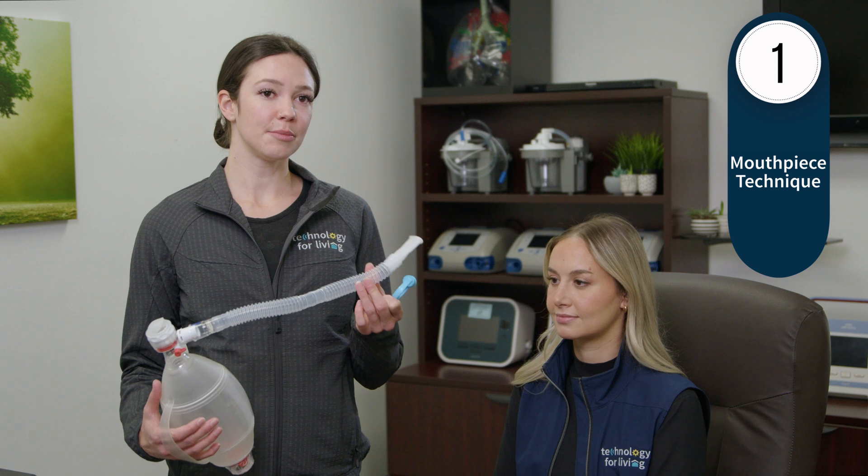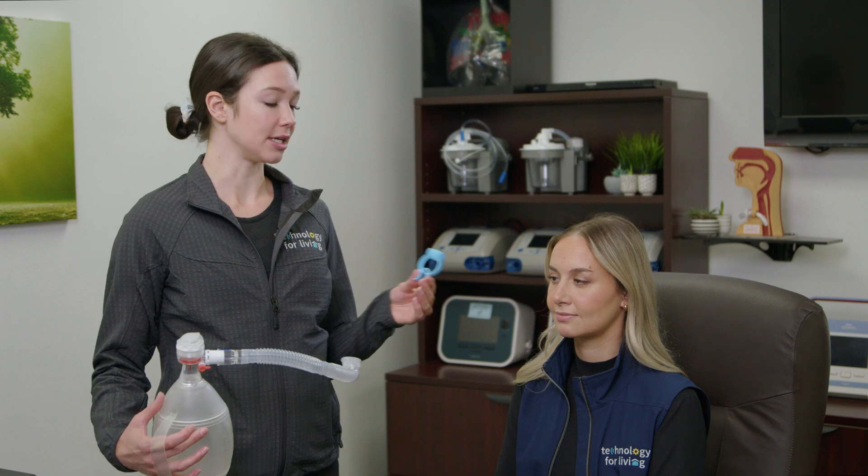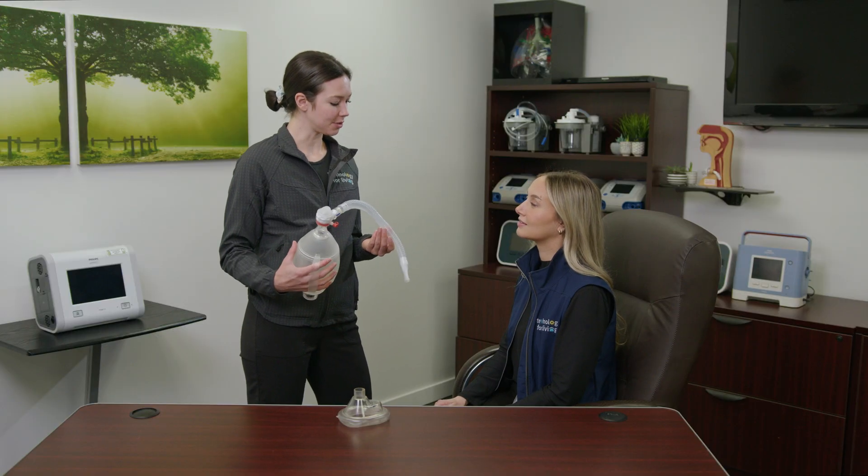To create a tight seal, insert the mouthpiece between the teeth and the lips. Keep a tight seal around the lips so that no air escapes around the mouthpiece. Nose clips will also help eliminate any air escaping through the nose, allowing the air to enter into the lungs.